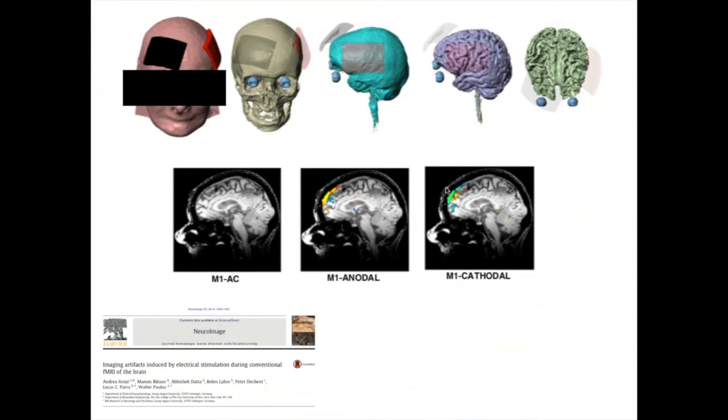As I say, we really don't see it. We've looked at the signal to noise underneath the electrodes. We see a slight loss of signal in the bone, so we do get a slight dip in the skull signal immediately underneath the electrodes. But by the time we get back down to the brain, there's no evidence at all for us that anything strange is going on. But as I say, that does seem to be a scanner and subject dependent thing.